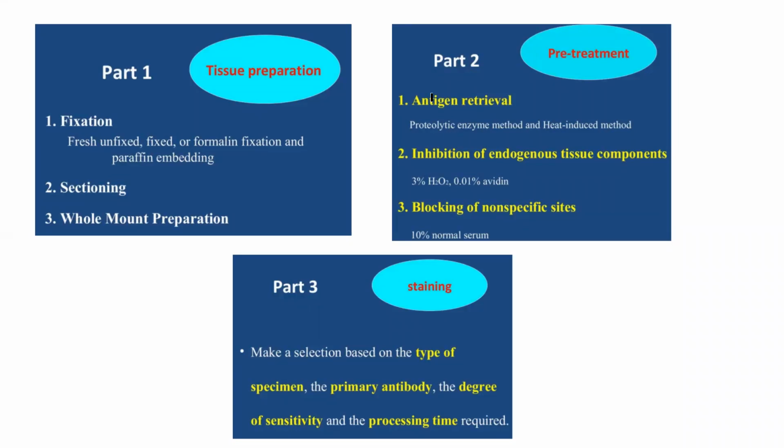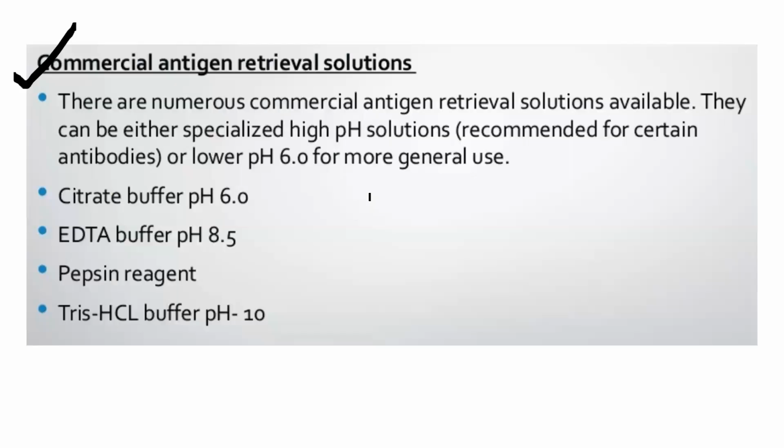In tomorrow's lecture I will discuss inhibition of endogenous tissue components. Maybe I will discuss it in detail tomorrow, but I would like to give you an overview of this entire immunohistochemistry in the coming slide. So kindly pay attention. Let me take one empty slide.